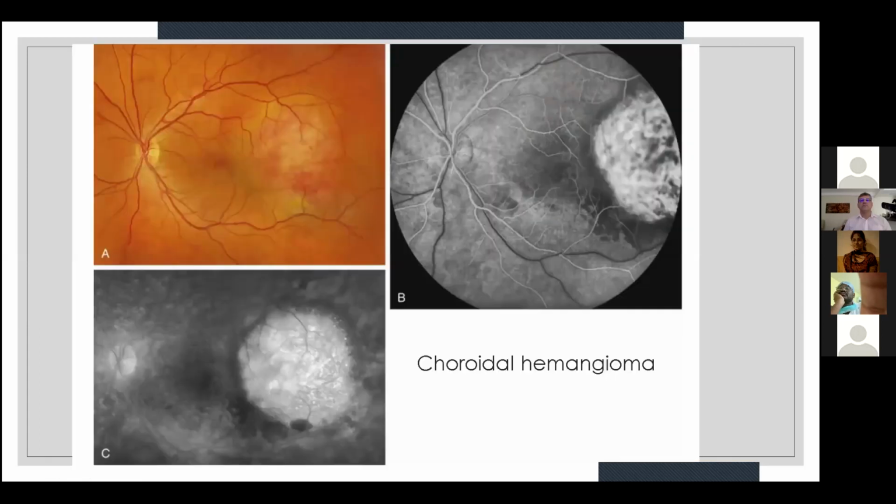This is a case of choroidal hemangioma. This is a fundus fluorescein angiography in the AV phase, as we can see the laminar flow, and we can see the hyperfluorescent choroidal hemangiomatous vessels depicting the new vessels, and there is increased fluorescent leakage by the end of the angiogram.